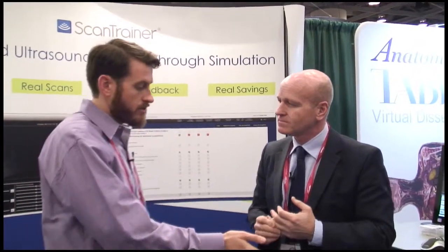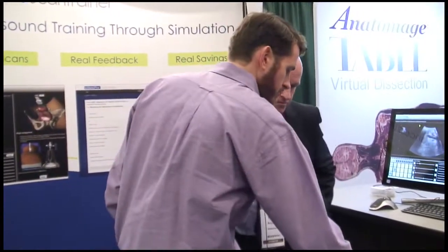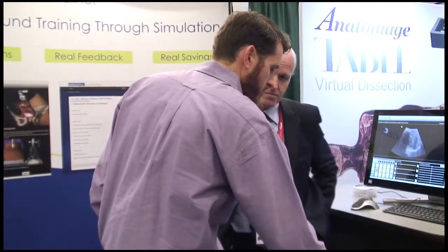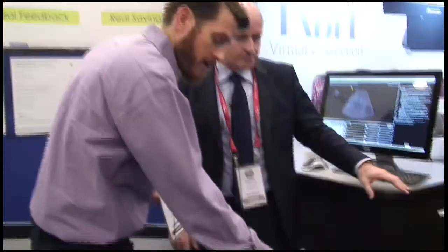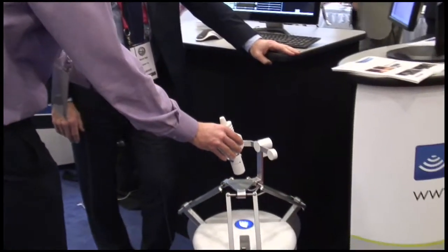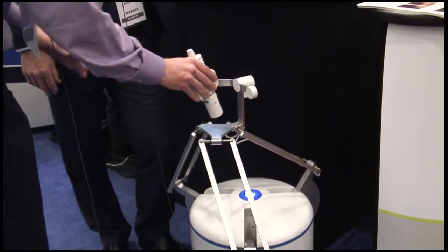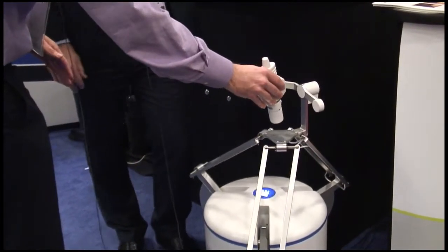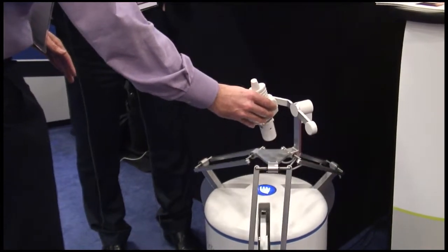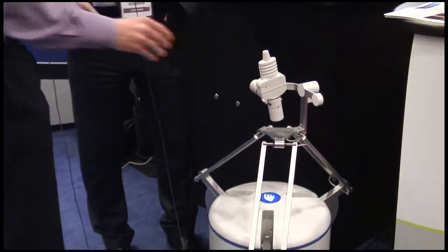I'm noticing this very interesting haptic device here on the ground — we kind of took a little test of it. When we move around, is it going to give me feedback so that it feels like I'm actually touching a body? Absolutely. It's actually feeling right now like I'm pushing down onto a body and there's tension pushing back onto me as I move the probe up and down — a very interesting feeling that can really mimic, as you said, exactly what's happening when scanning on the side of the body.